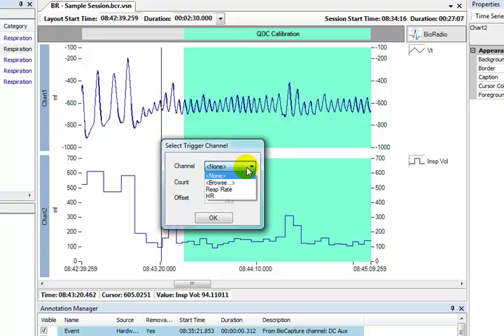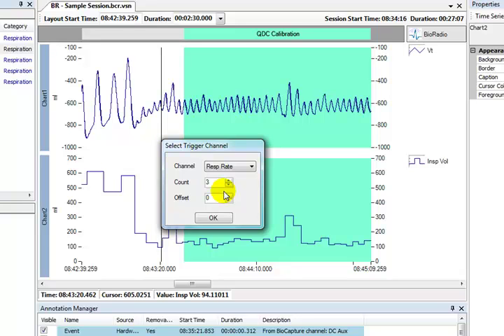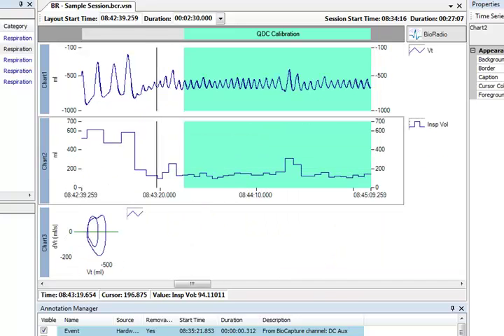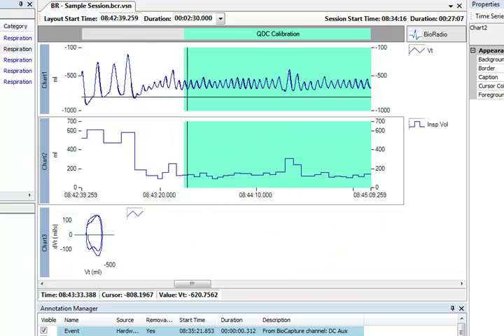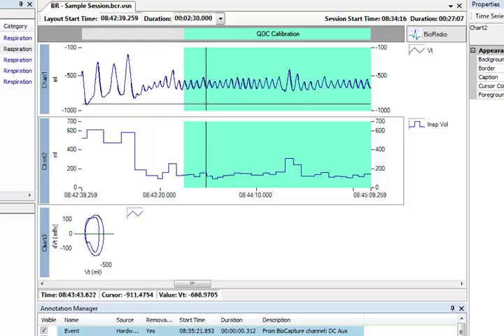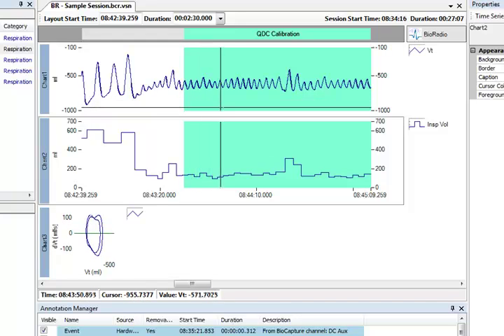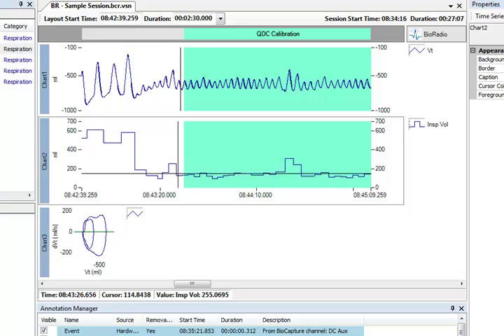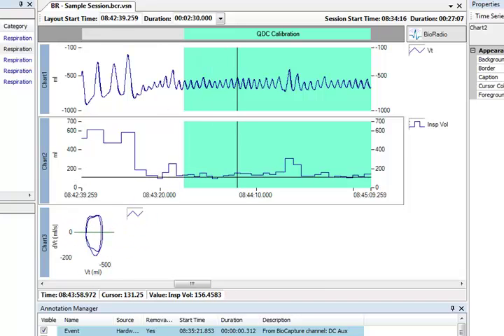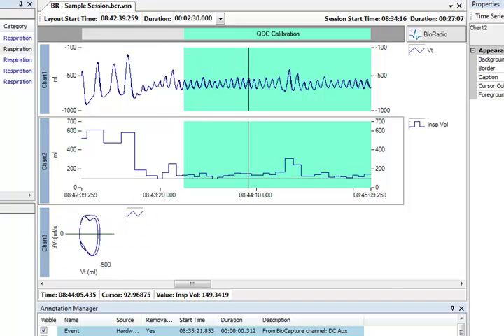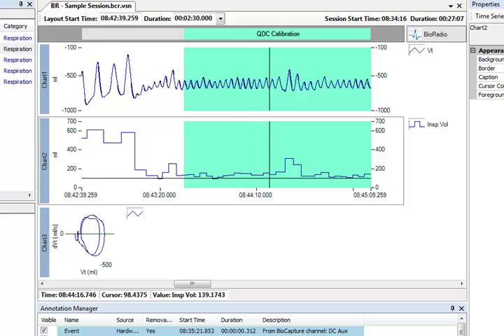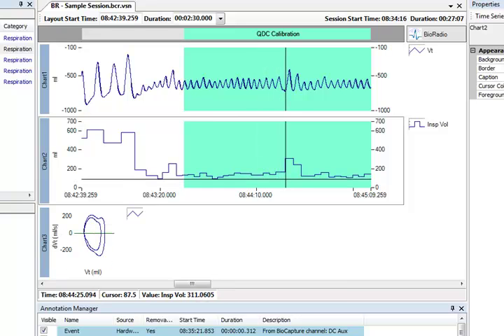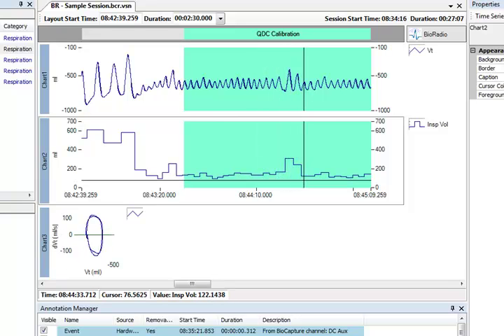The trigger channel is optional and when used it triggers the range of data shown on the phase plot. The trigger channel is usually set to breath rate or some other channel with a regular cycle such as respiration rate or heart rate. Once we select the channel we can also select the number of breaths or heart rate beats and the offset to be incorporated in each phase plot. Press OK to create the phase chart. Now as we move our mouse across the synchronized chart panel we can see how our phase plot, in this case flow volume loop chart, is updated for each breath. These loops indicate that no airway obstruction is present as they are all concave and not flattened.